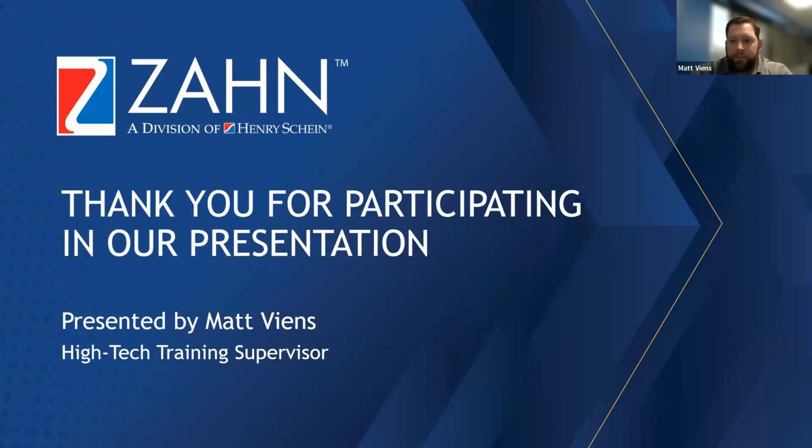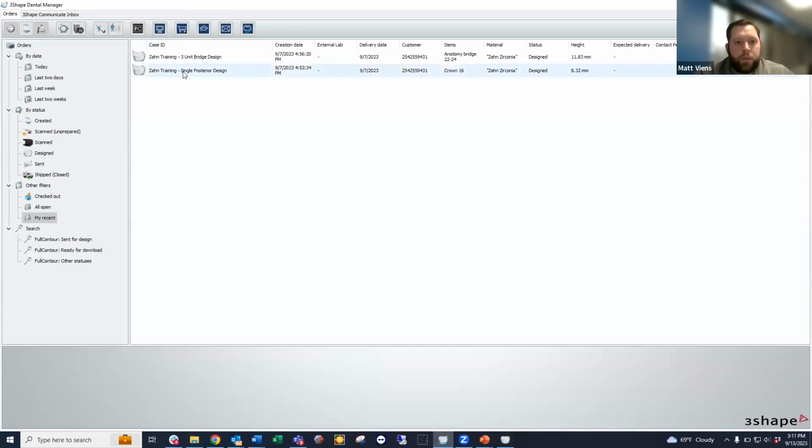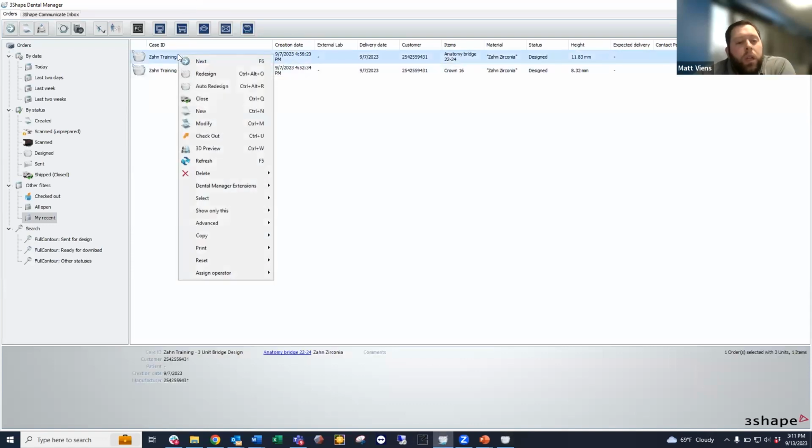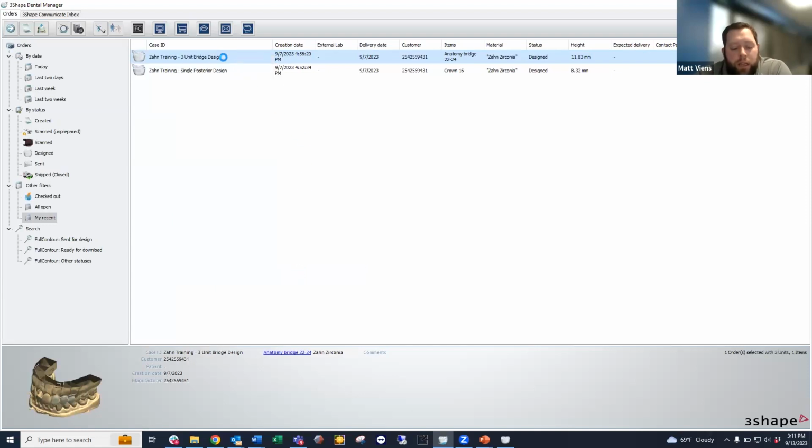Alexandra wants to know if you can please show again how you verified the bridge connections have the appropriate thickness. Yeah, of course. So going back to 3Shape. Well, let's see here. If we just look at the design, it's the same thing as the 2D cross-section does.